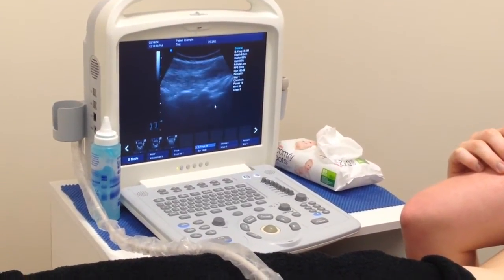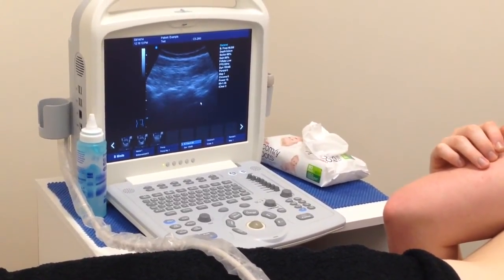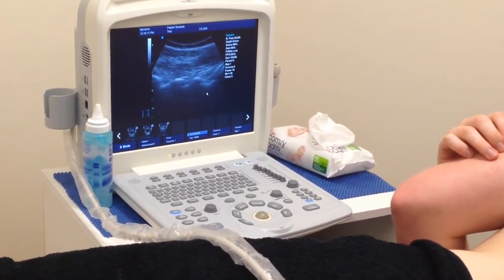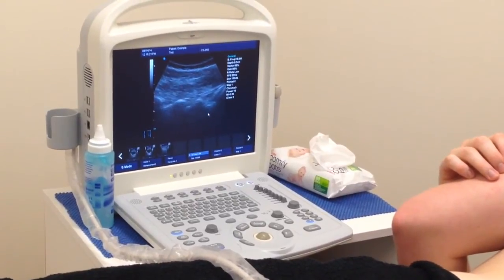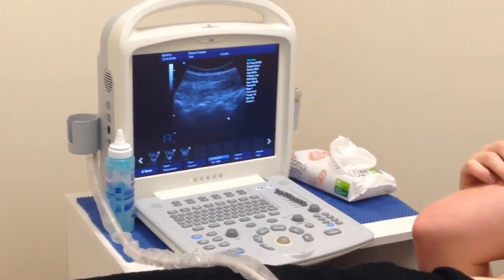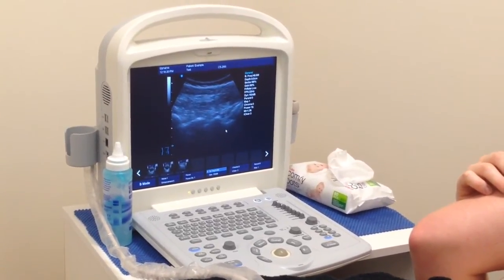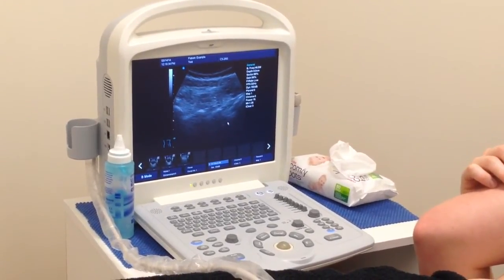Let's see if you can do that without actually moving your hips. So just imagine you're doing that same movement, but try not to move at all. Yeah, good. So we've got a nice gentle muscle contraction there. One more time. Perfect. Let's just see how long we can hold that on for as well. So just switch on, we'll count it out. 1, 2, 3, 4, 5, 6, and relax.